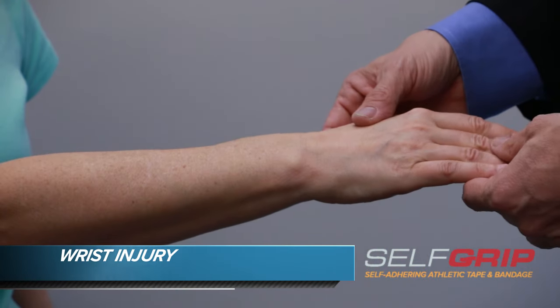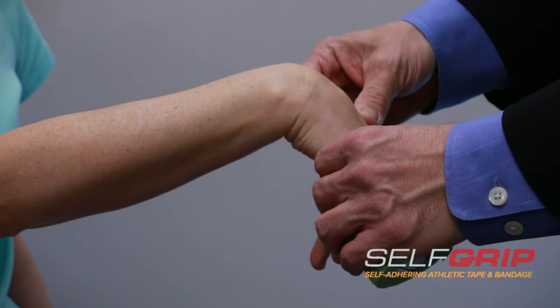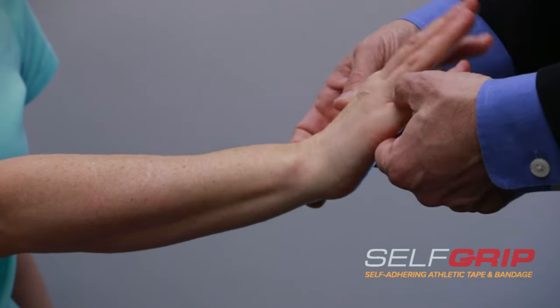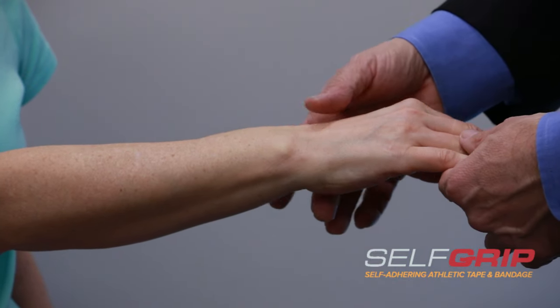We are now going to tape Sue's wrist. Common injuries for the wrist are flexing it or extending it beyond what it normally wants to go, and thereby straining either the top or the bottom of the wrist.